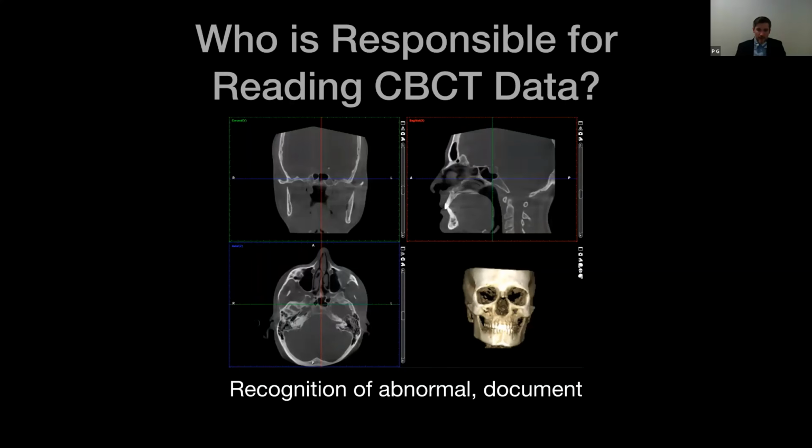Really it's just about recognizing, hey, that's not supposed to be there. It doesn't look quite right. Let's document and send the patient off for further evaluation. You've done your due diligence as the quarterback, and you have handled that situation appropriately. So no need to diagnose exactly what it is, just recognize normal from abnormal. And then follow it up with a written report, because if you didn't write it down, it didn't happen.